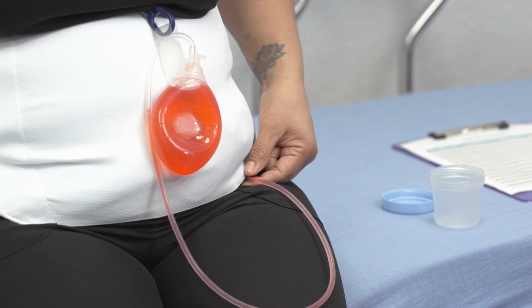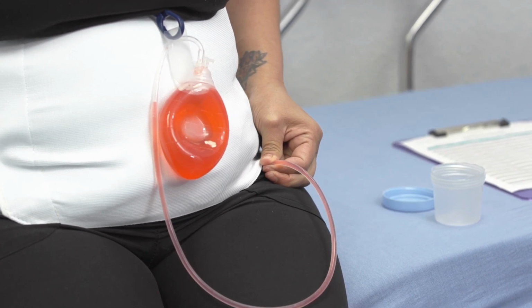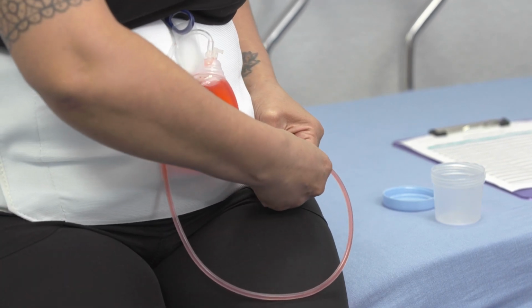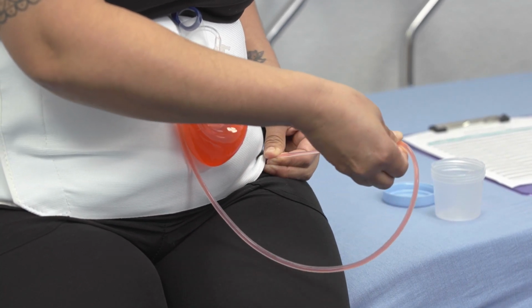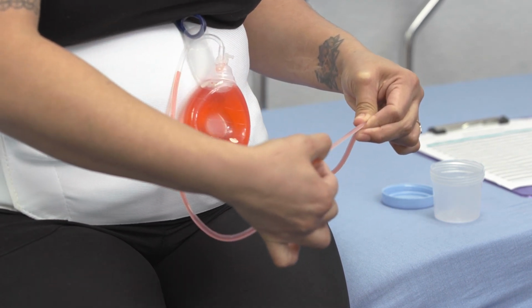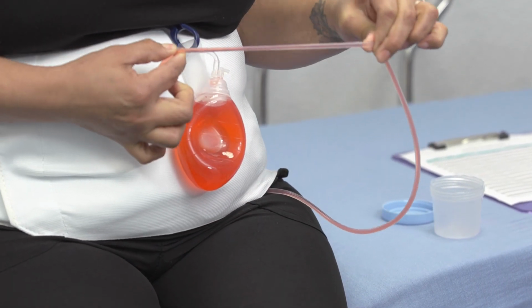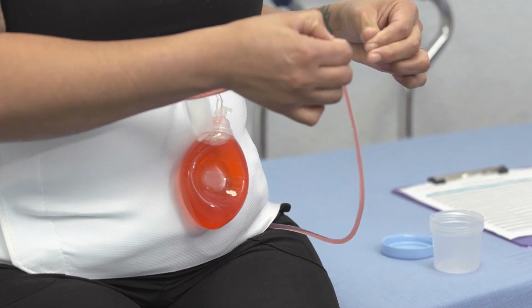With one hand, you are going to grab the tubing and hold positive control of it. With your other hand, you are going to come up to your fingers, pinch down lightly, and pull back. As you are pulling back, ensure that you are pulling only on the tubing in between your 2 hands and not actually pulling on yourself. You are going to milk all the way down to the bulb. As you are doing this, you're going to want to visualize that the fluid is moving from the tube to the bulb.